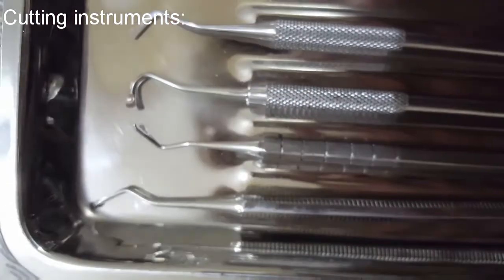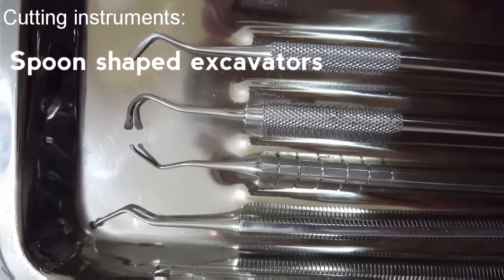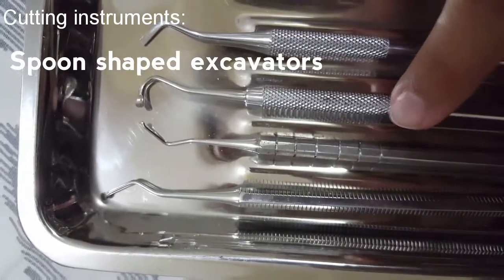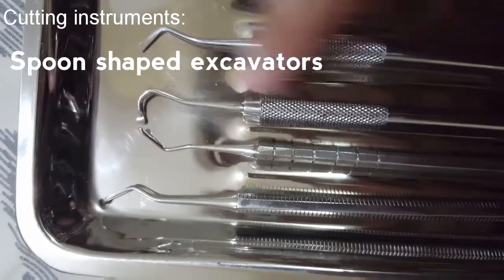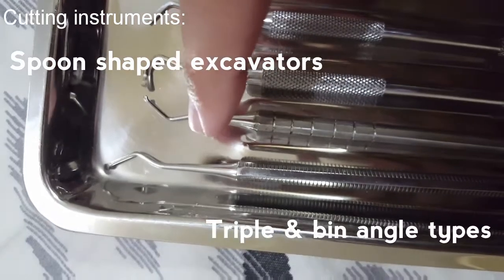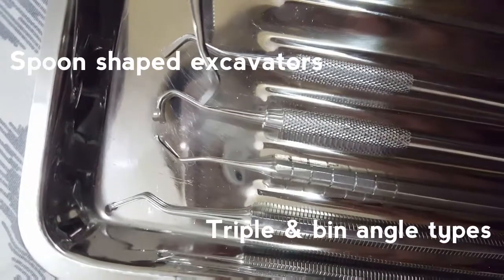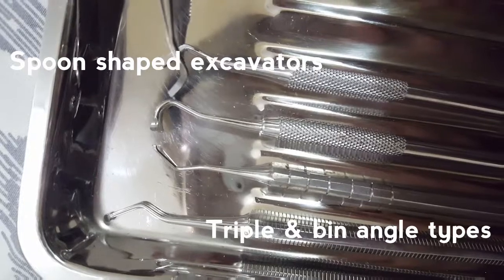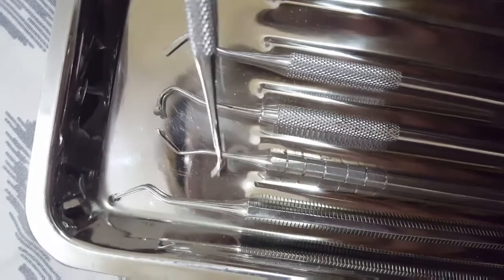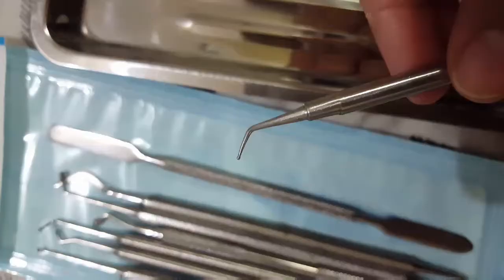These three are our hand excavators, spoon-shaped excavators, and these are just different sizes and different types. This is a triple angle. As you can see, it has 3 angles. These two are bin angle. Bin angle means 2 angles. See, 1 angle, 2 angle, and this is 3rd angle over here. So that's why it's a triple angle. And this is just 1 angle and 2 angles, so bin angle.